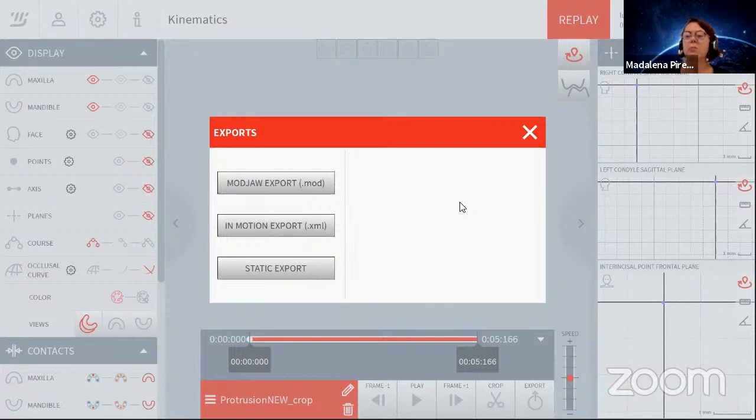So we have also more and more labs who want to have the software because maybe the dentist doesn't have the time, or has done an export, but maybe something is missing, and they prefer to receive the whole project and make their own exports. So this must be, of course, a lab that is very skilled in digital dental software and knows what they're doing, so they'll be able to work with this. So the dentist could send them the whole project, and the lab could now do their own exports.